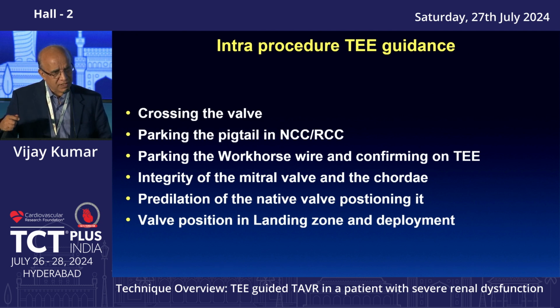There can be mitral regurgitation, there can be distortion of the mitral leaflet. All these things can be seen intraprocedurally by the TEE guidance and does not need any other imaging modality to make the procedure go smoothly.